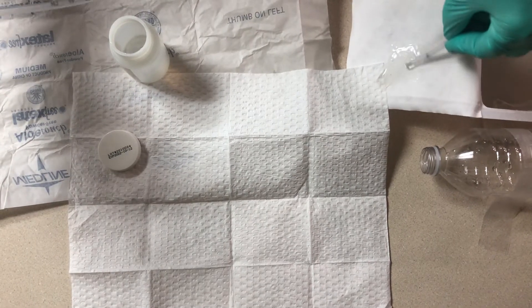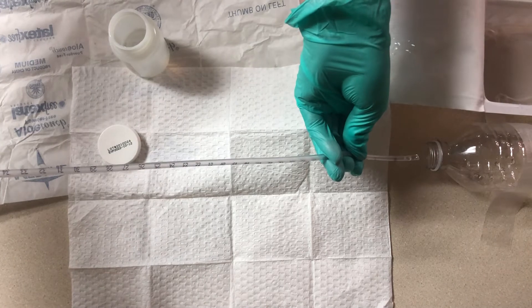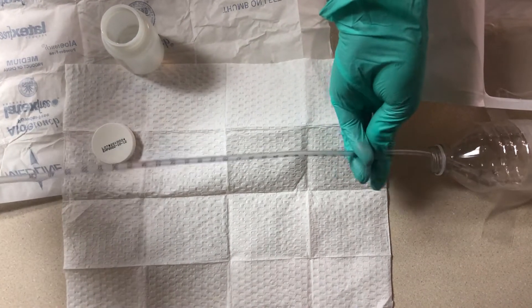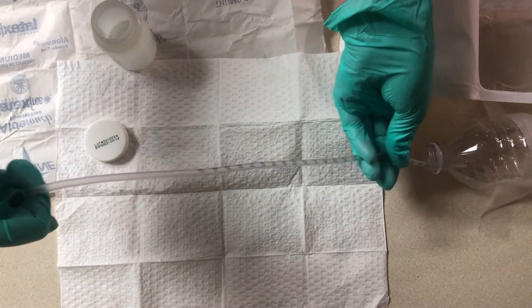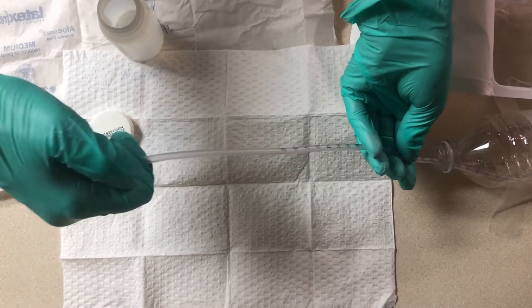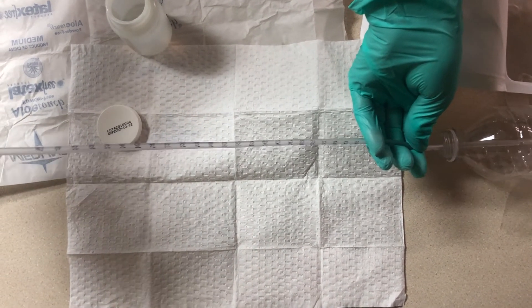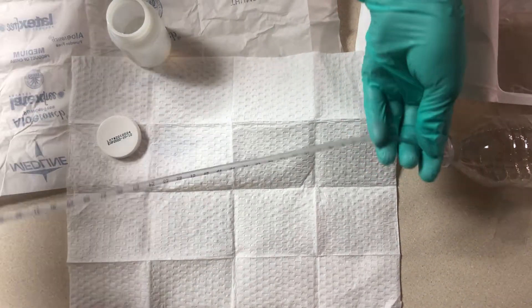Go back, get more lubricant. Keep the catheter taut, thumb hyperextended on your other arm. Gently pass the catheter without touching anything with your sterile hand until you meet resistance or the patient begins to cough. Apply intermittent suction, pulling the catheter out and letting it slide between your fingers so it's nice and controlled the entire time.